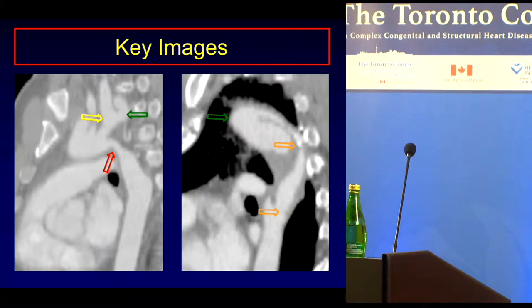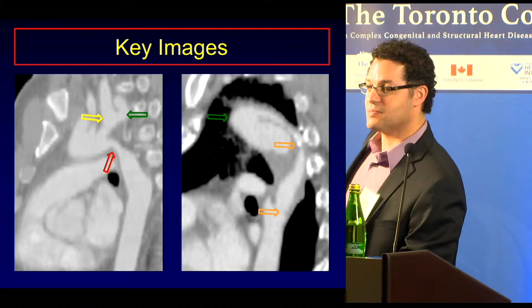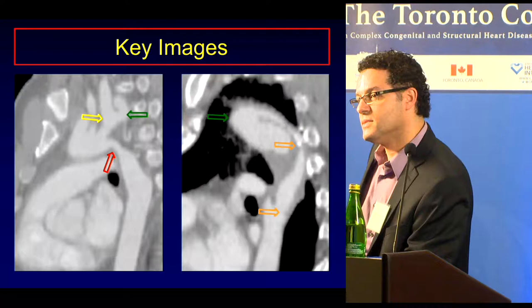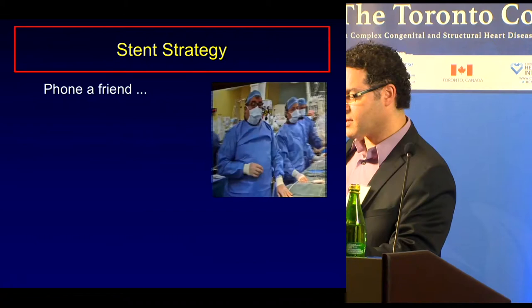I think to be very honest, what you could do is go up through the graft. I wouldn't go through the subclavian. I would go up through the jump graft, and I would try to put a covered stent and seal off whatever that bulge is. Landing a strut or two into the subclavian as it goes up and accept that I'm going to be slightly off there. Okay, we're concerned we've dehisced away from the subclavian. Yes. Well, I know, but you have to cover that, right? Did you do it? Yeah. All right, so hang on. I have an order here, so that's Eric.